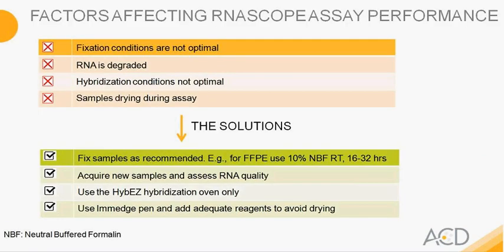So for troubleshooting tips, I want you to highlight some of the factors that we know affect the assay performance.